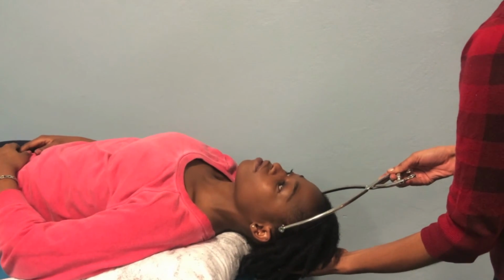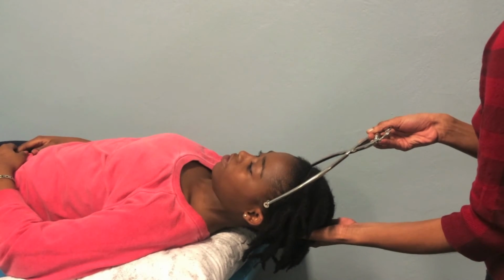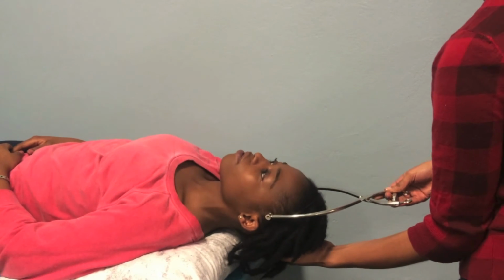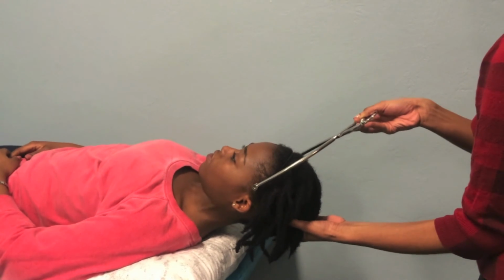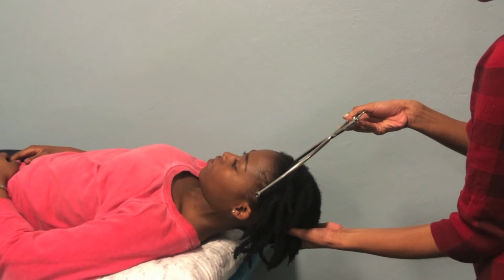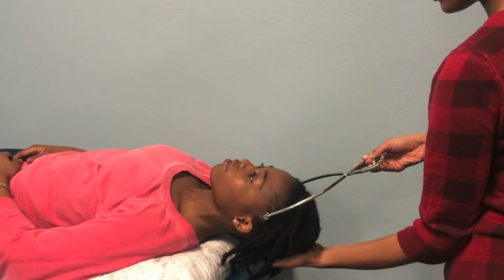For example, a C4 injury will require a maximum of 8 kilograms in 1 hour. Repeat radiograph checks until the cervical spine has been distracted to the point where the facets can be unlocked and reduced by extension. Serial neurological examinations must be done each time weights are added.